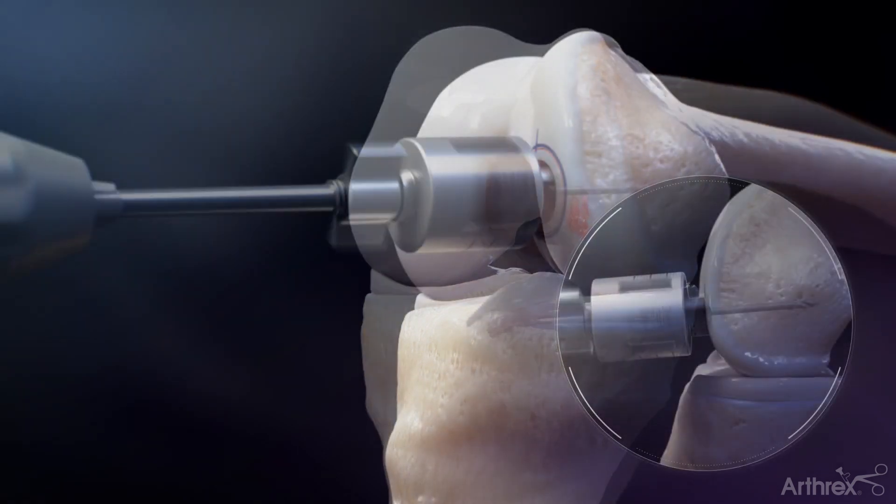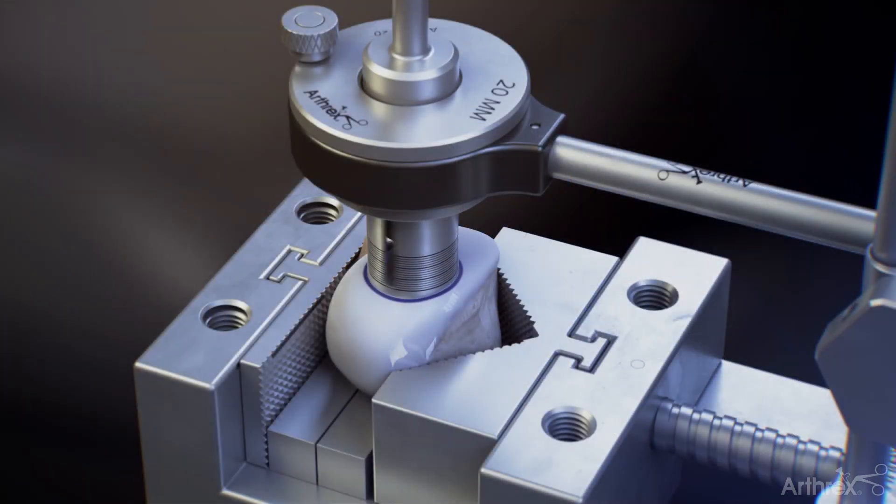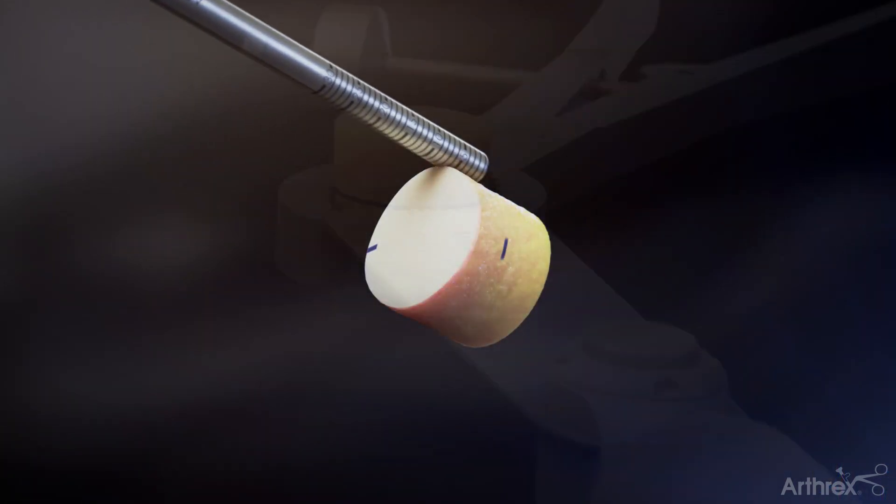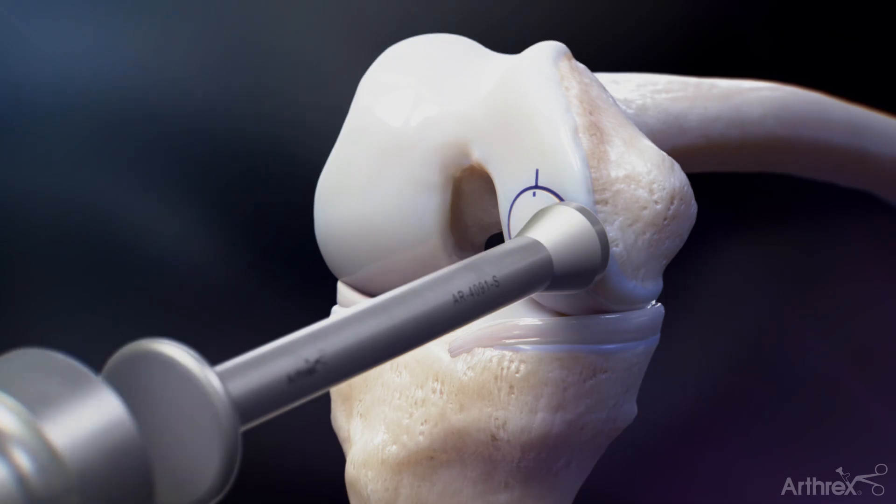The allograft OATS system for cartilage restoration allows for the efficient treatment of large, symptomatic lesions of osteoarticular surfaces.